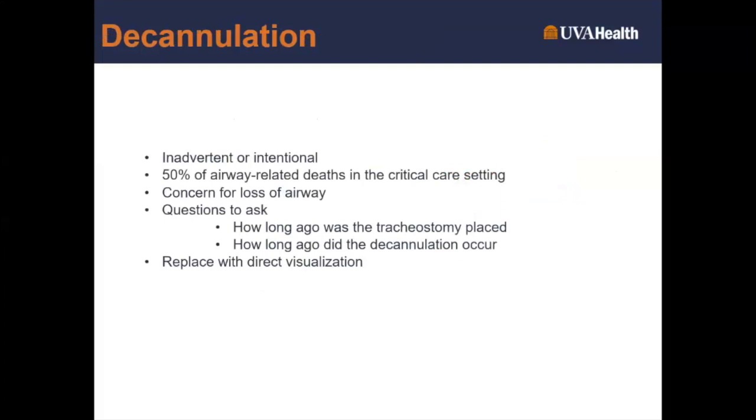Now, why is that? It doesn't matter if the patient just got their trach 10 minutes ago, or if they've had it for a couple of years. Eventually, that opening is going to start narrowing and closing. So the highest risk patient population is certainly that patient who had their trach placed 1 day ago, 1 week ago, 1 month ago. However, even established stomas, that opening in the neck itself, even established stomas will start to get smaller over a period of hours.